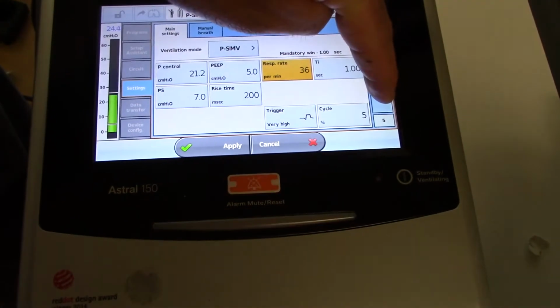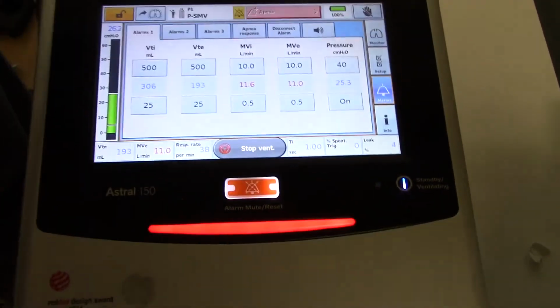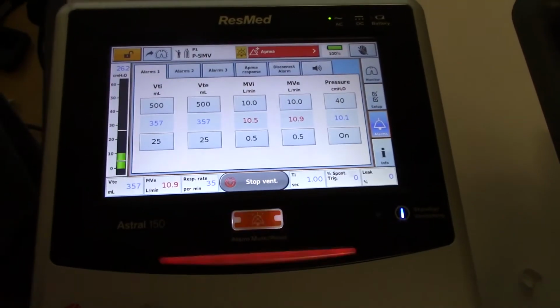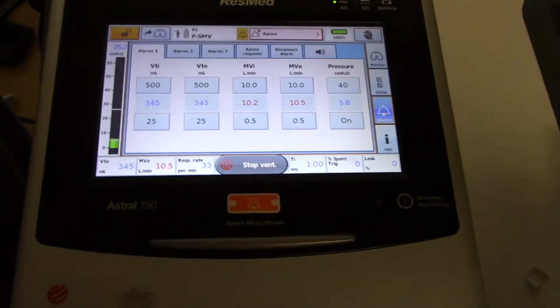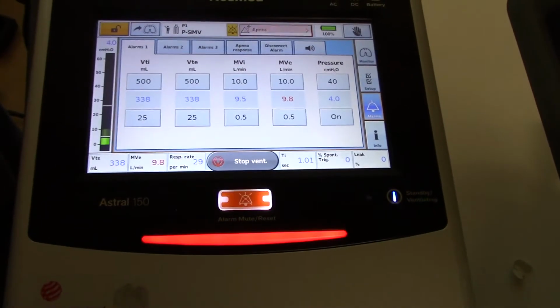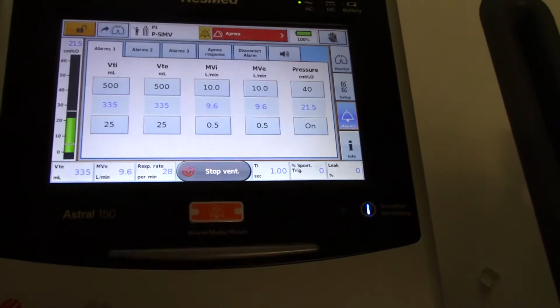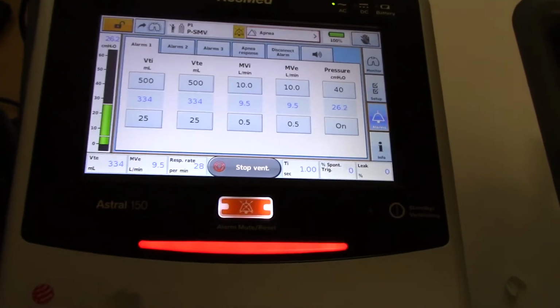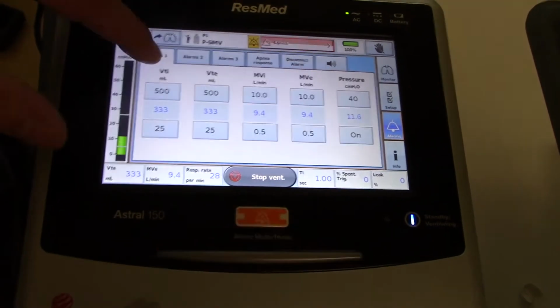Okay, now let's look at alarms. We're going to do the same alarms in our policy minimally. Minimally meaning this vent will do the alarms that the servo does and then some. So we're going to set our alarms minimally here as we do on the servo, and any extra alarms that this has you can set as well, but they're not going to be covered under policy. You know how to set your alarms, and you're going to do that here as well. You can see it has multiple different alarms available.